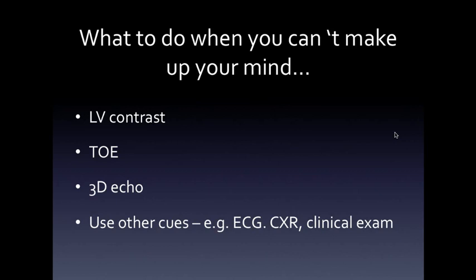We use a moderate amount of it. There are downsides to LV contrast. I've seen anaphylaxis with it. There are contraindications to it. But it can be very helpful to opacify the left ventricle. It's particularly useful in stress echo as it happens.